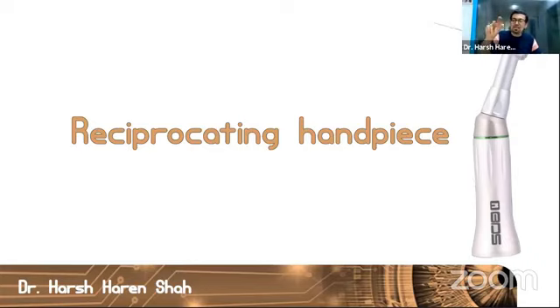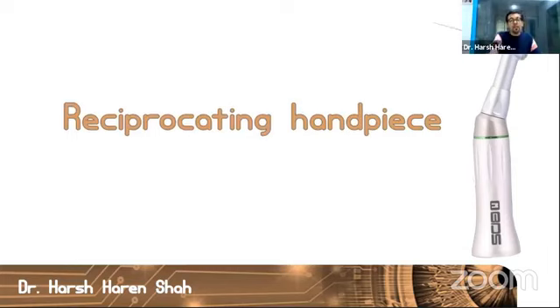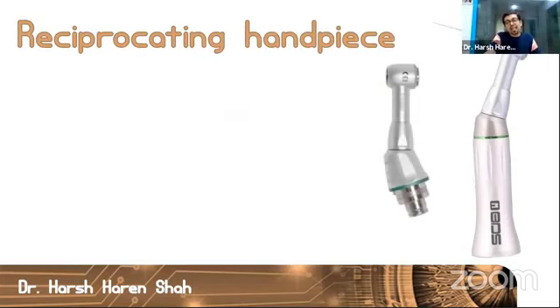They bring about the same reciprocation movement of the file. Now these handpieces can be connected either to your micromotor directly, or if you want to use it on an endomotor, you can even connect it to an endomotor. This will fit most endomotors that are present in your clinics. So this is completely your choice, whether you want to connect it to a micromotor or to an endomotor. They have both the options available.